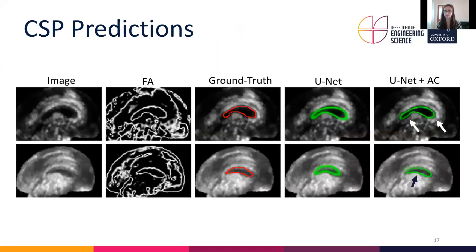Subsequently we trained the U-Net with these updated labels. Two examples are shown from the fetal brain dataset. In the second column the feature asymmetry — the edge map we used — is shown. In red we have our manual ground truth, and the two green columns show the standalone U-Net and the U-Net in combination with active contour correction.